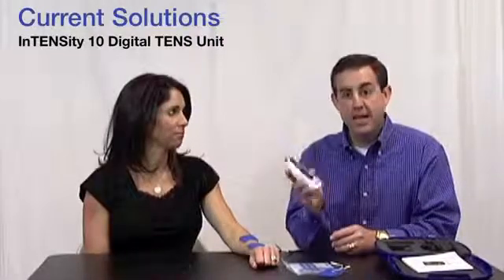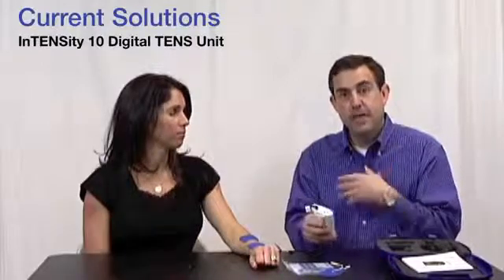On the TENS unit itself, I just press the S button until I get to the wrist icon. Once on the wrist icon, I turn the unit up — I hear the beeping — and then I ask Allison, or if I'm doing it on myself, tell me when you can feel it. Once she feels it, I want it to be strong but comfortable. If you're causing pain, you're doing the opposite effect. So turn it up until it's strong but comfortable.